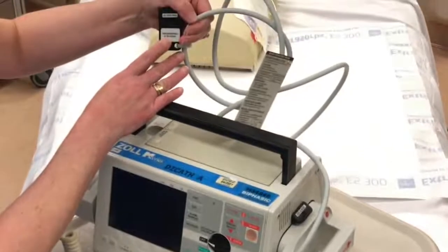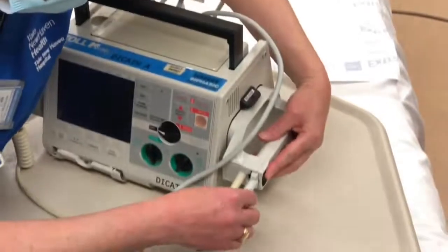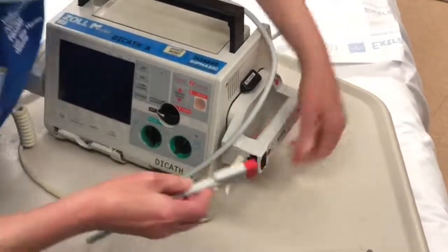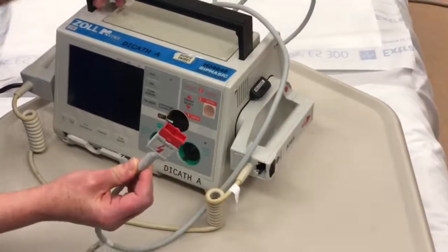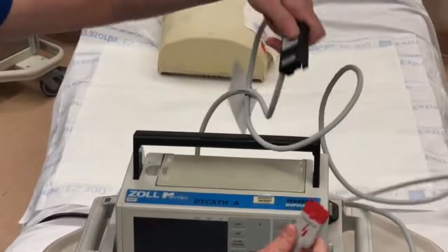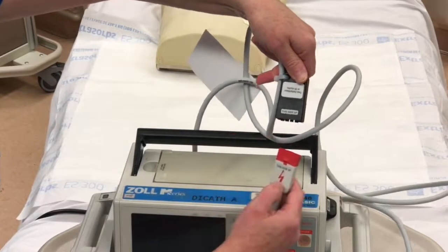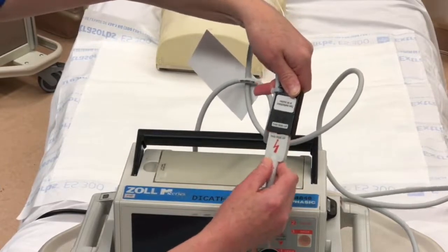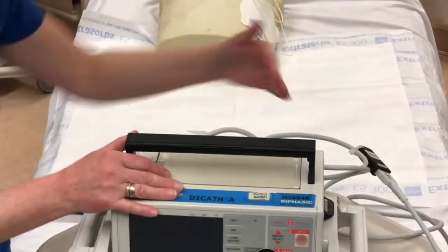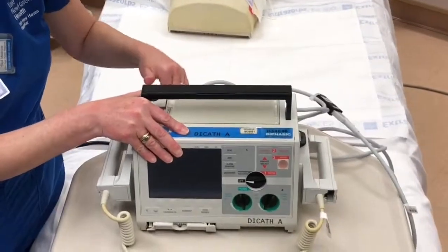In order to remove the multifunction cable from the paddles, one must pull up on the release button here and free the multifunction cable from the paddle. If your multifunction cable is in the test plug, you will see this side up message, and you're looking for that lightning bolt. In the back of the defibrillator is your power cord, and also the 3-lead ECG cable.